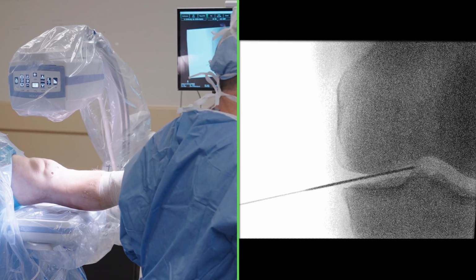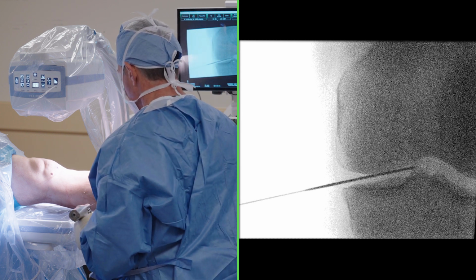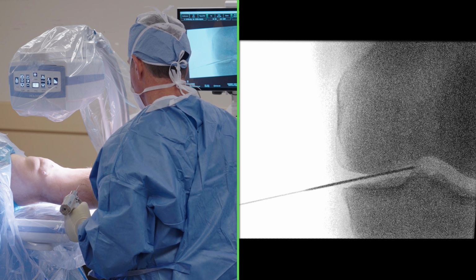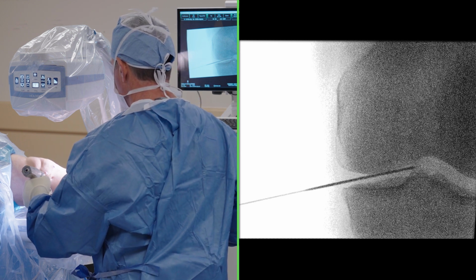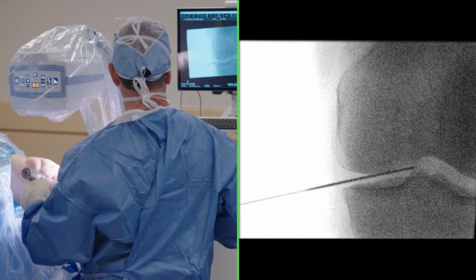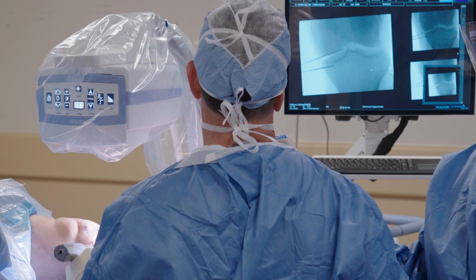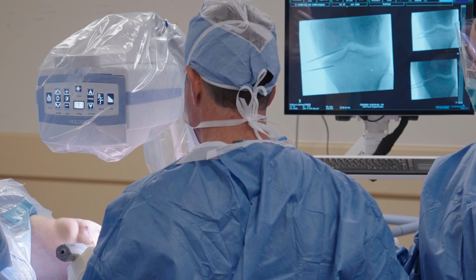Pin, please. So what we're going to do is, I place the spinal needle dead center where the degeneration is. I'm going to try to center it, and I'll probably go just behind it and just in front of it. We'll start with the tibia. Fluoroscopic imaging in the anterior-posterior and lateral planes is utilized to confirm proper pin placement. So I want to be just beneath the subchondral surface.